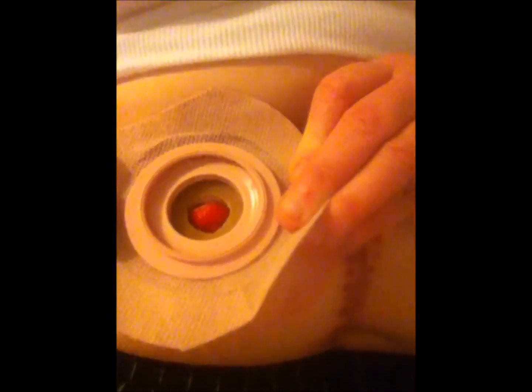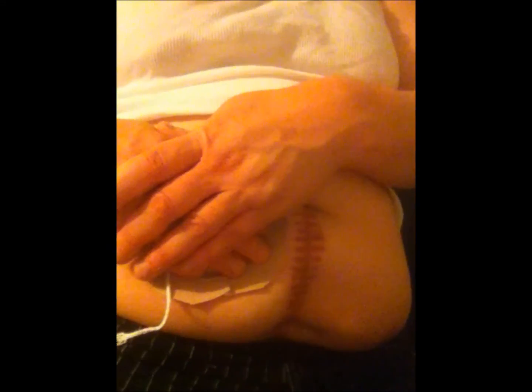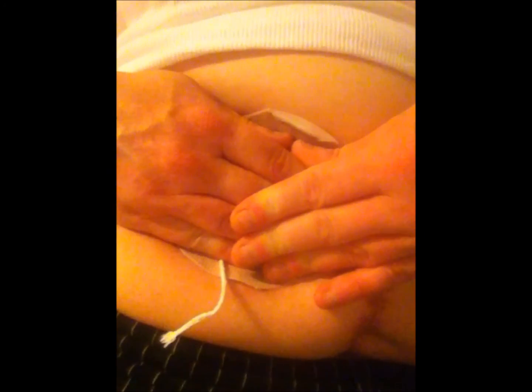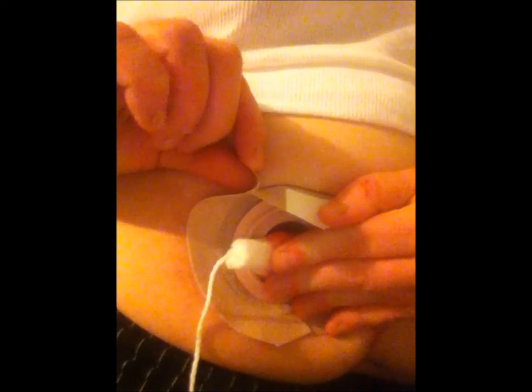And now I'm going to place my wafer over my stoma. Now, once I do that, I put the tampon there to keep it from leaking, because it does send urine out of my body, well, probably one every 4 seconds or every 3 seconds or so. It's very healthy, and so I put my hand over it because the ostomy nurse told me that my hand is warm, and it will make it to where it will kind of form better, and the adhesive of the wafer itself will just warm up, and it will stick on my body better, and we want it to stick really well.